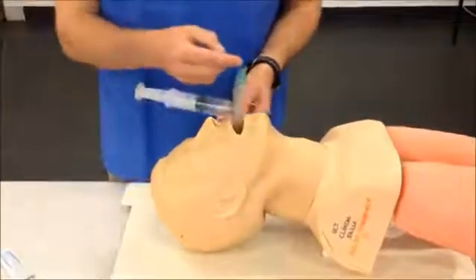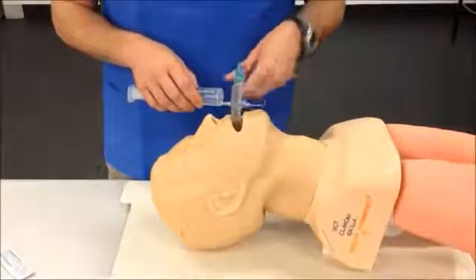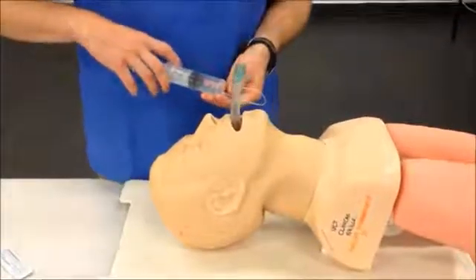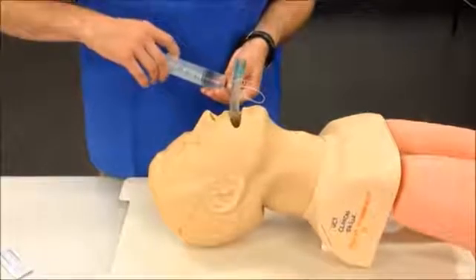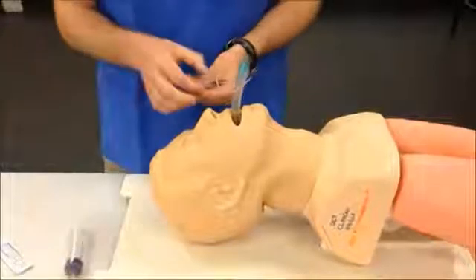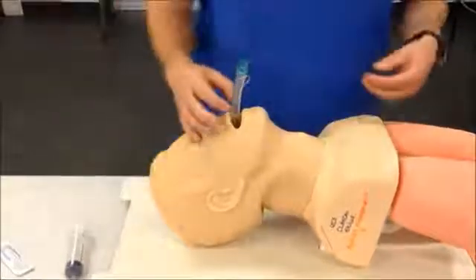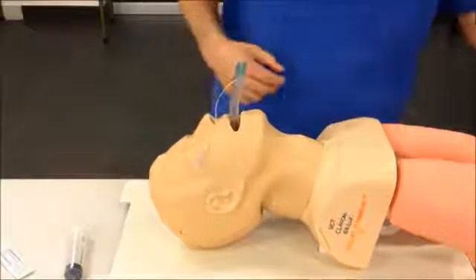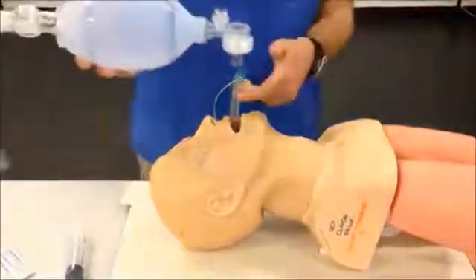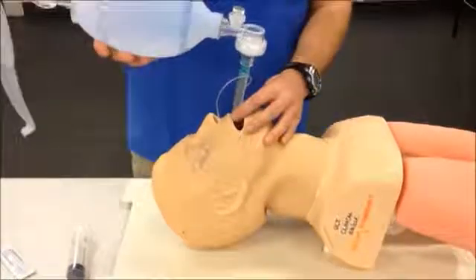It's important not to touch the tube itself so that the LMA cuff can seat itself anatomically without interference from outside forces. As we inflate it, we can see the tube seating, and we confirm good pressure in the pilot cuff bulb. One would now ask an assistant to secure the tube with their hands while attaching a ventilation device, in this case a self-inflating bag valve device.